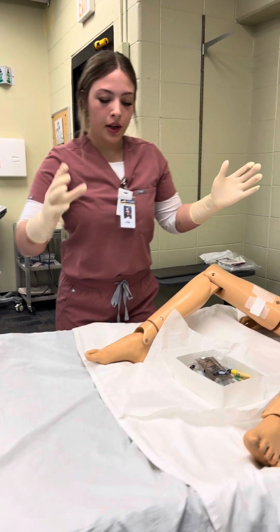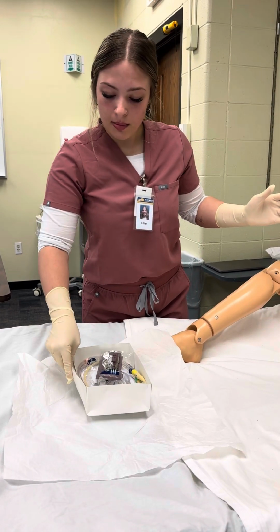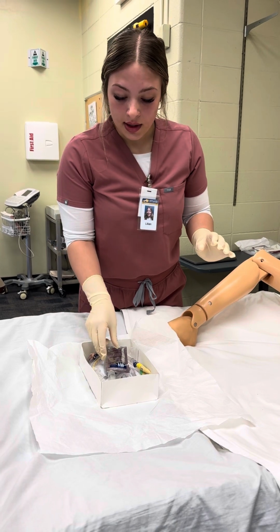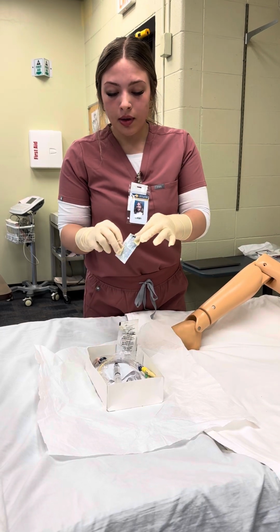Okay, and then I'm going to go ahead and scoot over my box and set up my supplies. I'm going to move my box closer to me, maintaining that 1-inch barrier. And then I'm going to set up my supplies. So I'm going to open my cleansing swabs, and then open my lube.